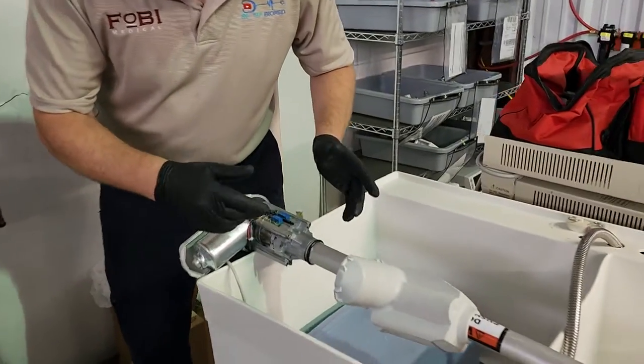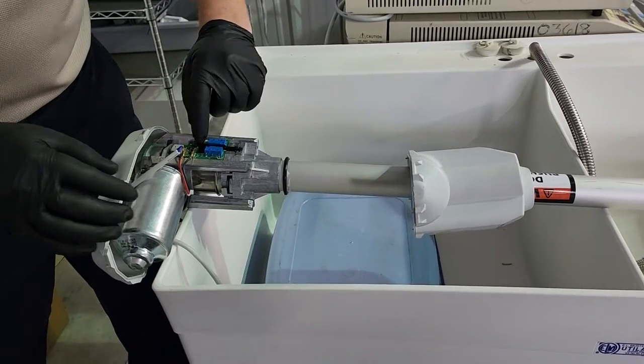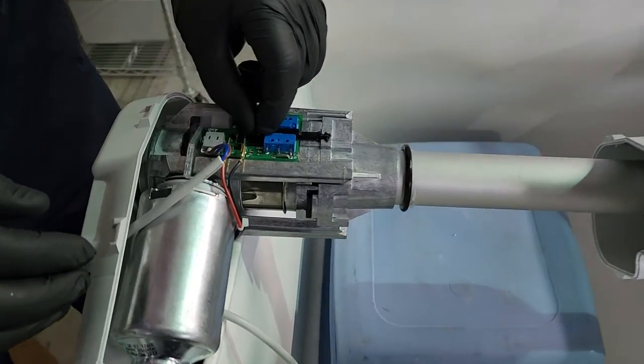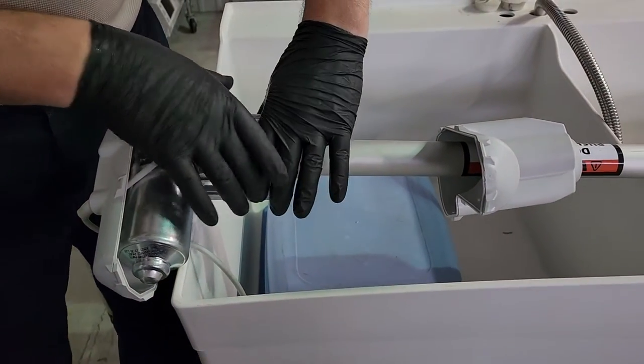What I need to do is separate the motor from the shaft. On that one over there I've got a limit switch right here which is defective. So how we're going to solve this is we're going to separate the shaft and motor assembly.